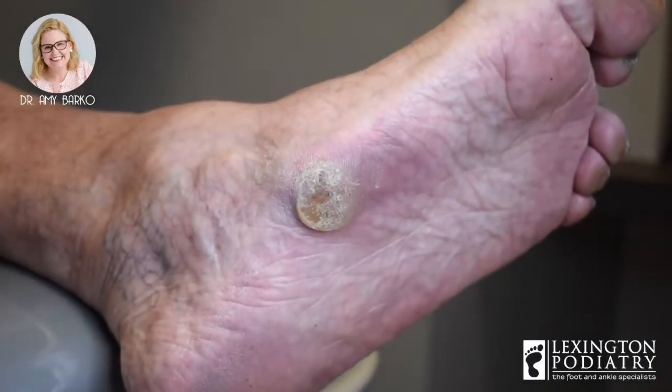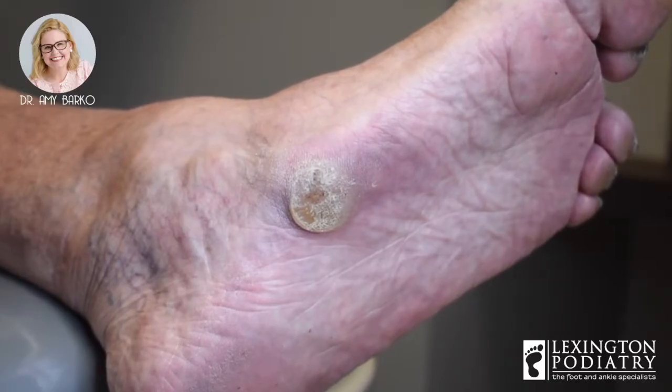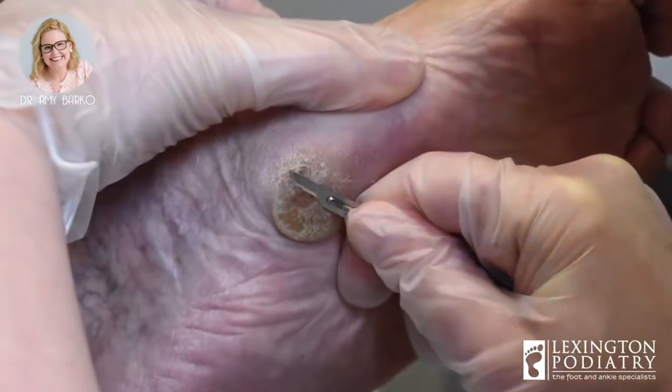So we've got a blade handle with a number 15 blade today. This is a scalpel. You can use all different sizes. This is my choice. This is what I like. So we're going to trim it.